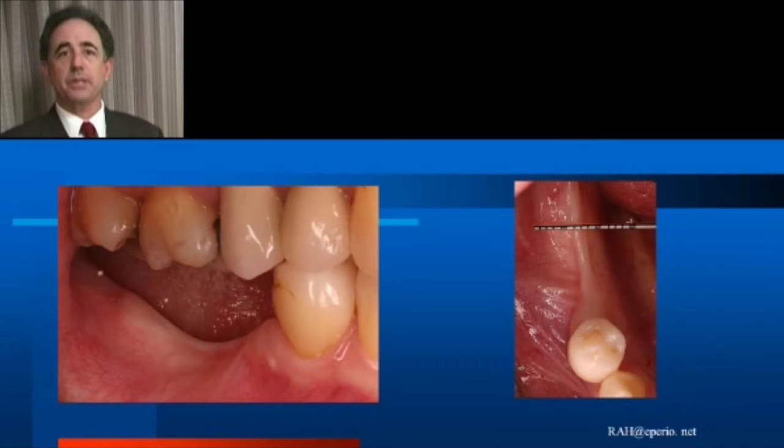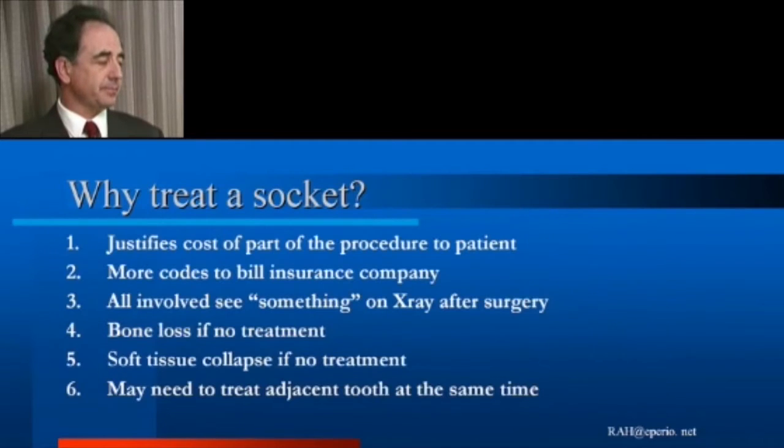This patient as well presented after extraction and healing of the site. You can see rather than a 12 millimeter alveolar ridge width, which we would normally see around a lower molar, the ridge width is only about 2 to 3 millimeters with only 1 millimeter of keratinized gingiva. Again, an unaesthetic, physically unacceptable site for placement of dental implants.